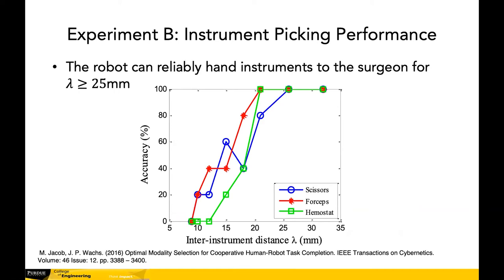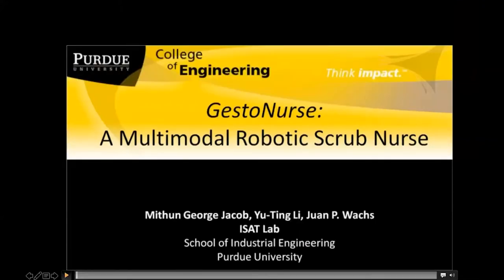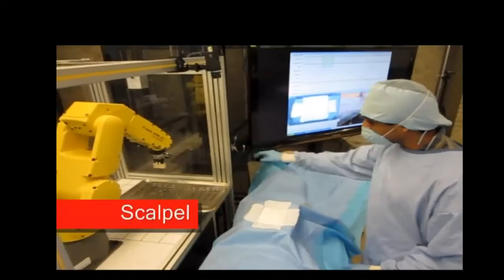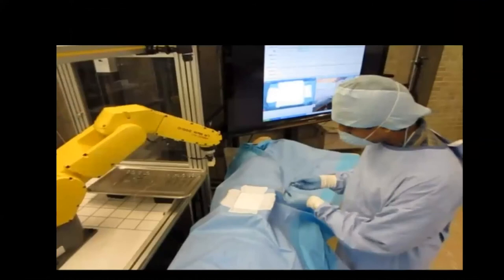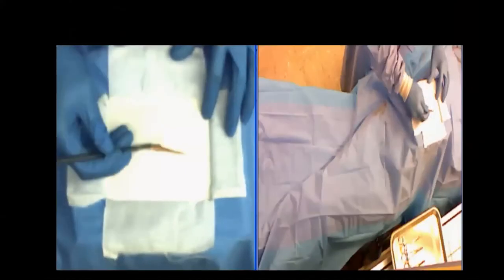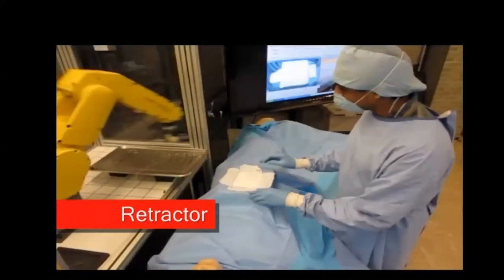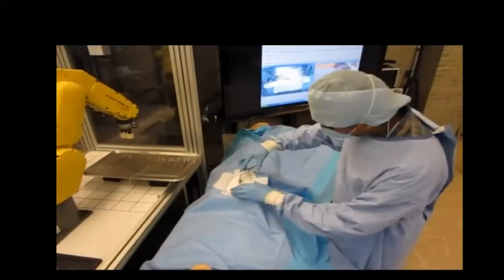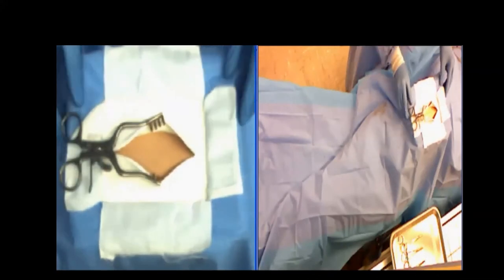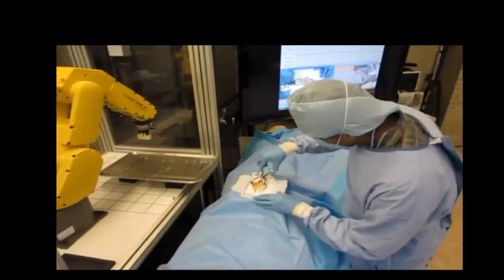Let me first show a little demo of how the system was working then, with the first prototype. So you see, this industrial robot was very shaky, but fast. We wanted to make sure that we match the speed of the assistant. Some of the requests, as you see, are performed using hand signals only, and some using spoken commands, okay?